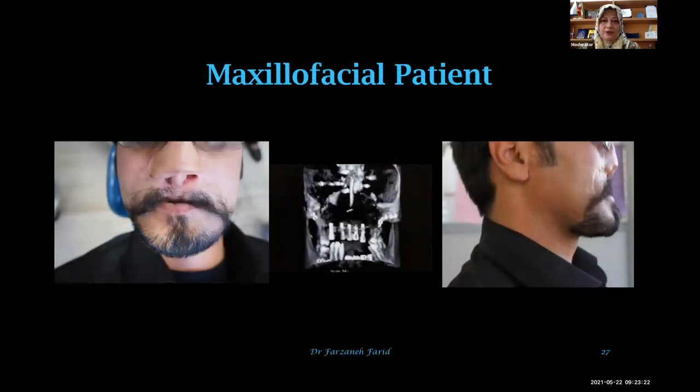This is another patient. He has a problem with the nose area, and what you see as the nose is a skin graft. He had a lot of surgeries, more than 30 surgeries. The last one was they got bone from one of his toes, and they put implants inside it. And then he came to us for putting the prosthesis on the implants.